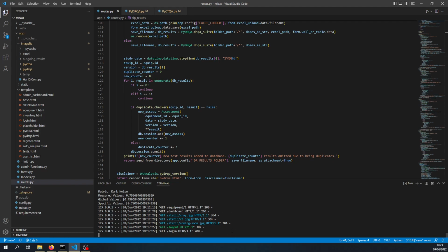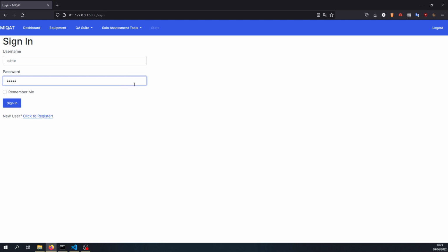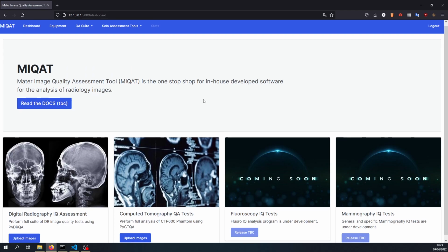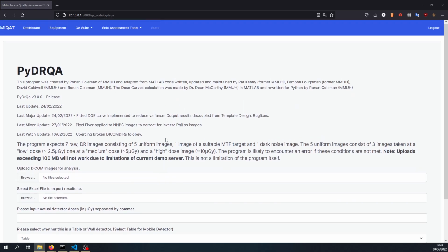And you can see in the console window here what's going on live in the background for the web application. It's just getting the relevant equipment pages and the different static files that are going to be presented. We'll soon see in the real application how this works. You can also control the number of users who can access the program with user profiles, and that can be helpful for assigning unique privileges or access requirements.